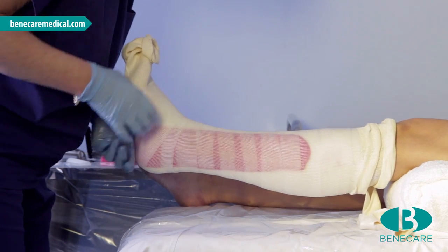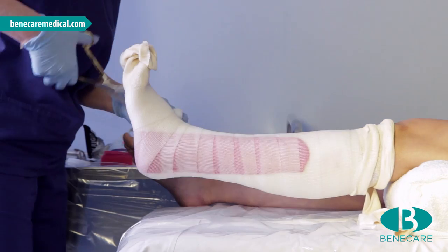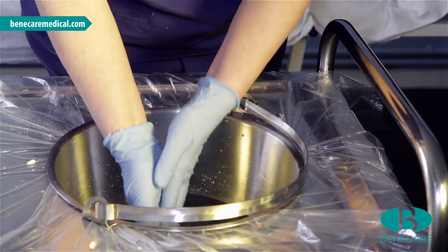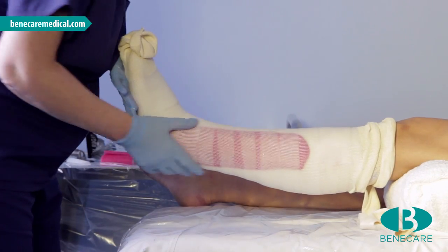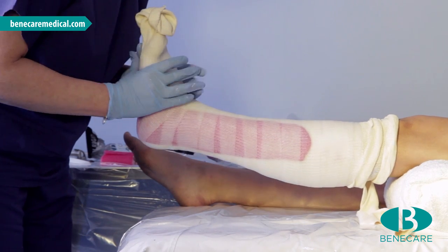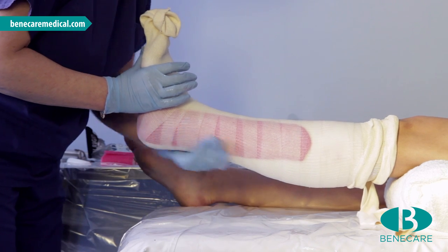As with the first bandage, stay under the first metatarsal head, capturing the fifth. Dip hands into a bucket and mould the cast into the contour of the patient's limb. The cast will take four to seven minutes to set, and as the second layer is wet, it will take four minutes to reach the green stage of polymerisation.